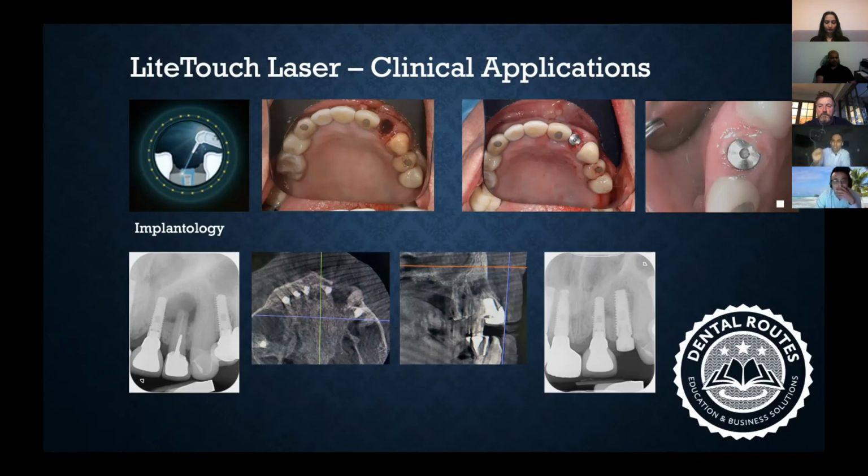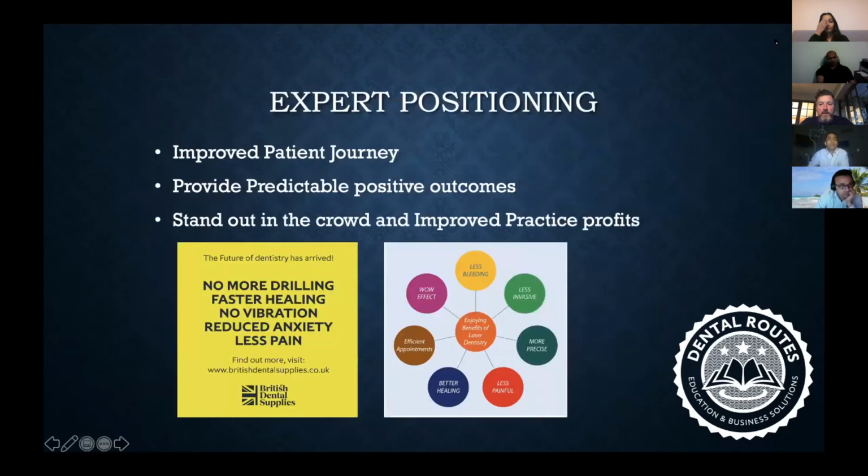I think Darshan was asking the question to Kaushik, would healing be quicker, and what type of healing happens? It basically reduces inflammation, improves blood flow, and the primary healing is quicker due to the way lasers affect the mitochondria in the cells in terms of biomodulation.